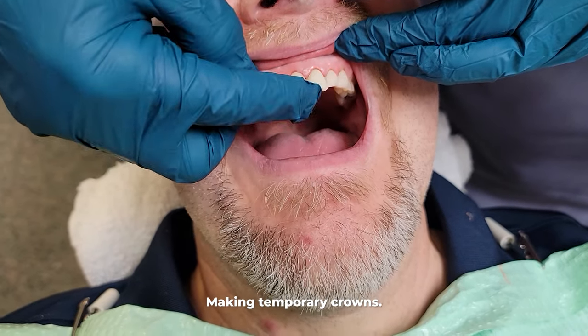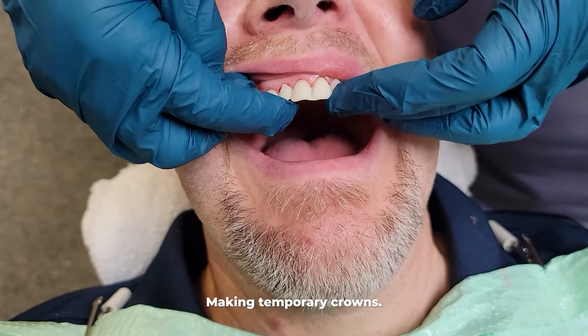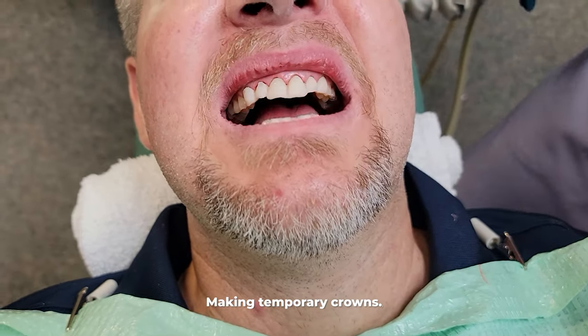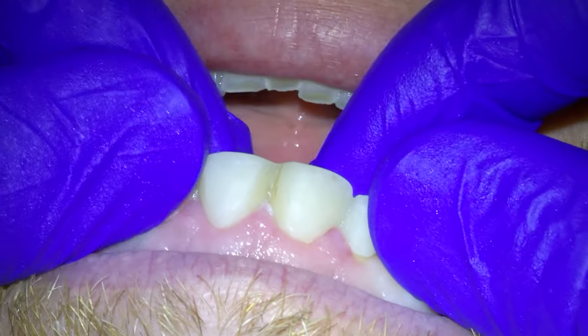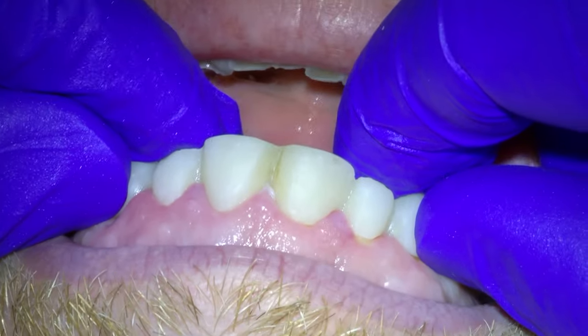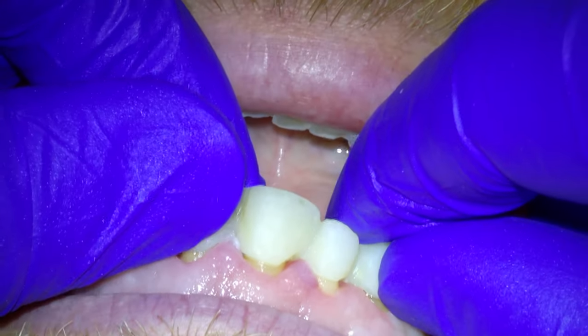What you've been seeing me do is take the hardened material and smooth out all the imperfections of the temporary — and there are a lot — until we get it to look somewhat cosmetic. Once we have those temporary crowns looking pretty good, we use temporary cement to attach the temporary crowns to the teeth.